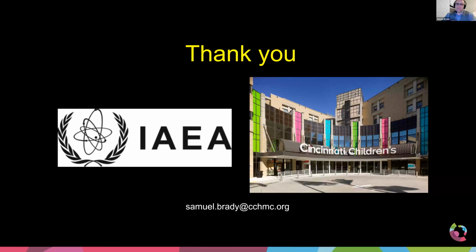But that's nice. So going forward, in the next probably 5 years or so, every scanner is going to have that, where you'll go in, you'll get them as best as you can centered on the scanner, and then you'll walk out of the room, and then you'll do the localizer, and then the system will know to move it up or down. But I have some more examples of that, so we'll talk a little bit about that in the next one.